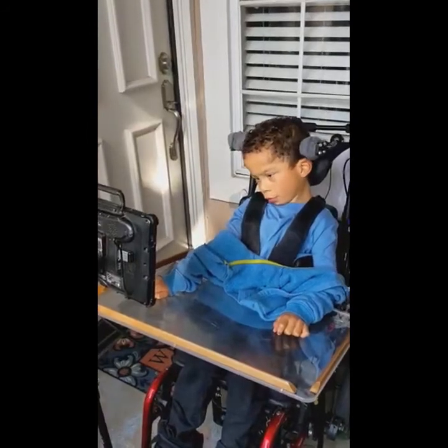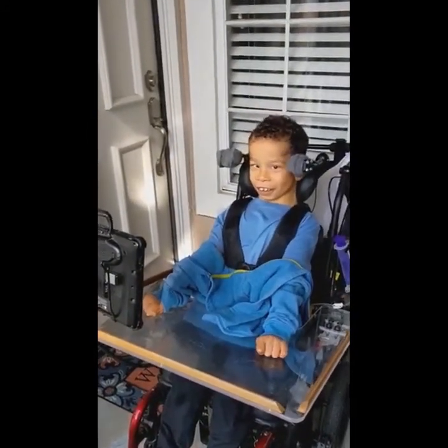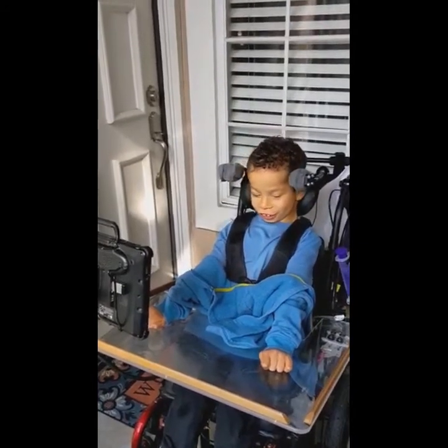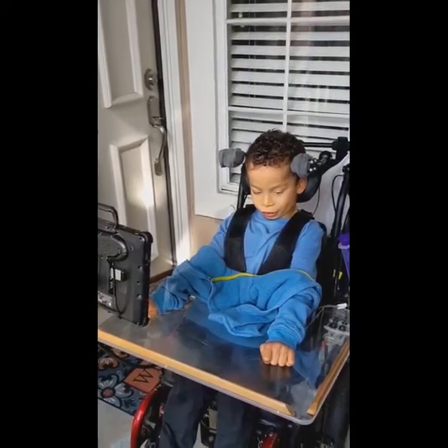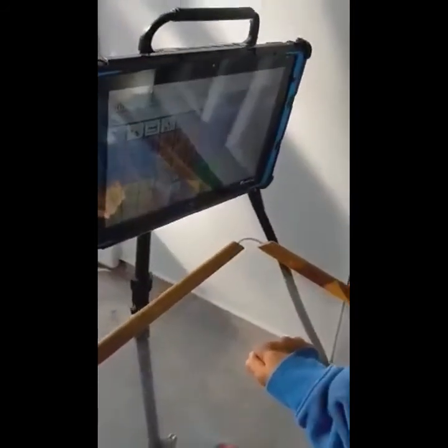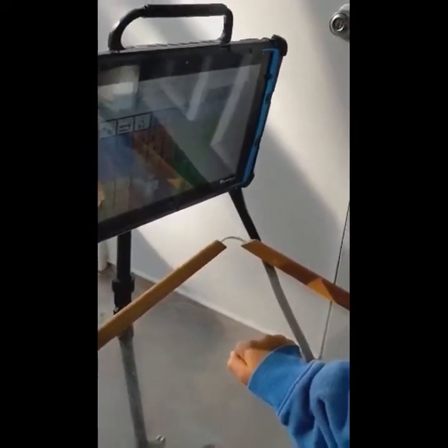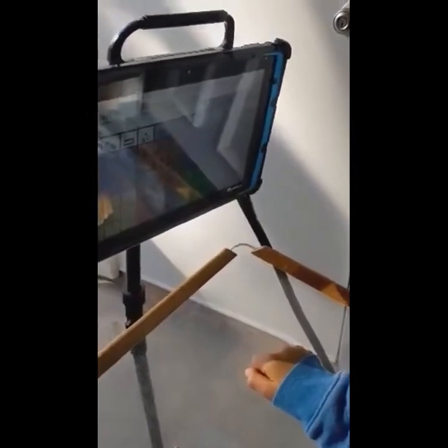Okay, so this is Tyler. Hello. Hi. Hey, Tyler. Thanks for saying hi to everyone. So here's Tyler's screen. And Tyler, can you just kind of move through some of your choices? So he pushes on one of his switches and it moves through the different choices on the screen. Hello. And then he uses the other switch to pick one.